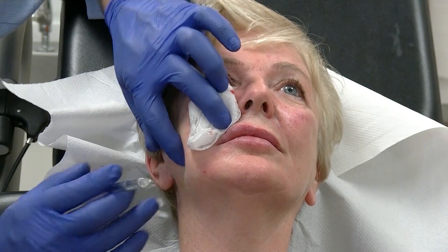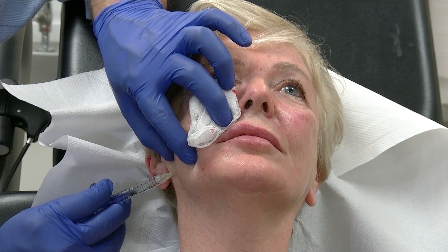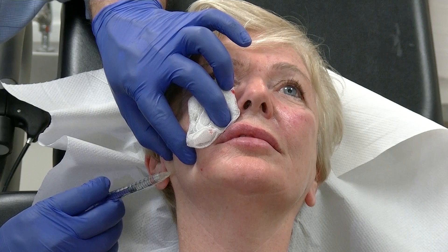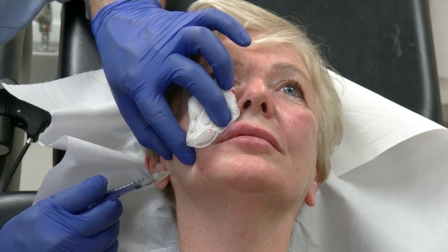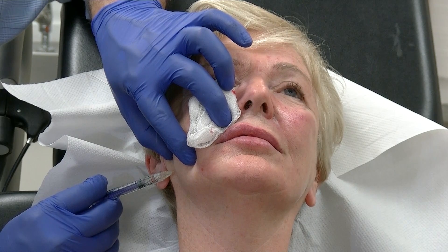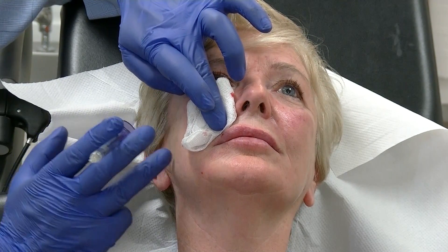Here's the angle of the mandible — elevate, sharp scratch, aspirate, and inject another 0.25. Then with the preauricular region, we're going to be using a cannula just to spread the treatment a little bit wider.